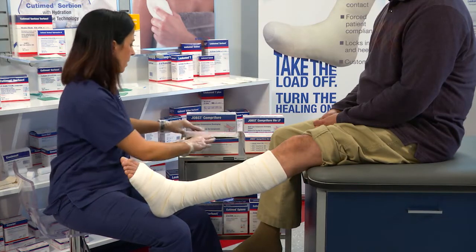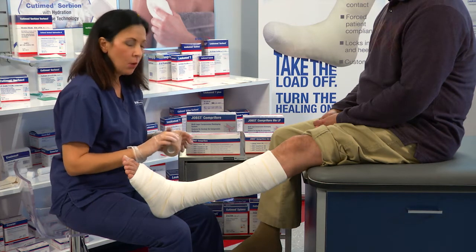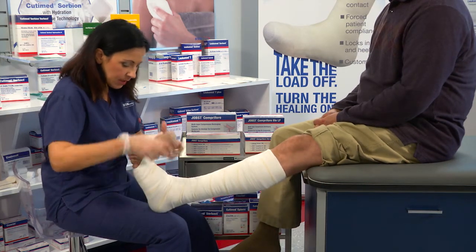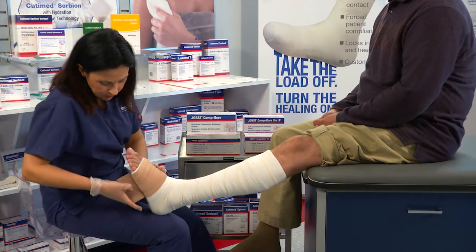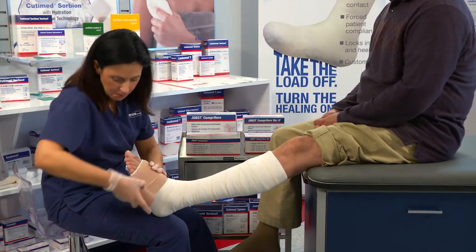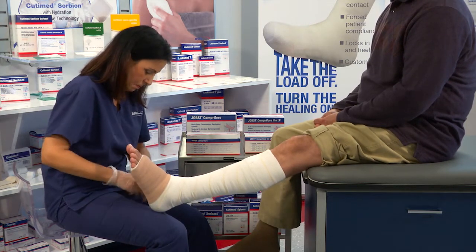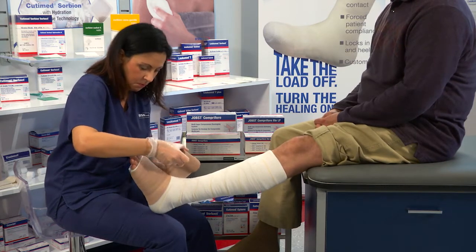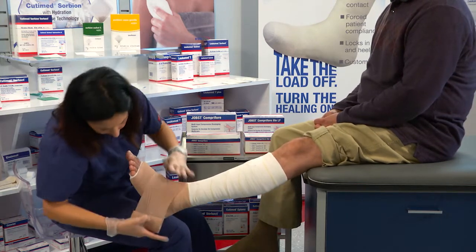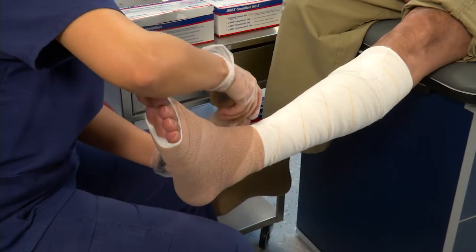Next, we're going to apply layer number four. Layer number four is a short stretch cohesive bandage and is your second layer of compression. We're going to apply this in a 50% overlap spiral fashion with 50% tension. We're going to start at the base of the toes and anchor twice around. When we get to the ankle, we're going to do a figure of eight and come back and capture the heel.